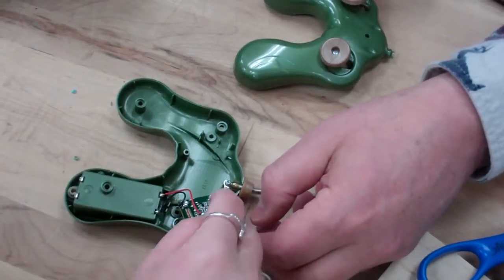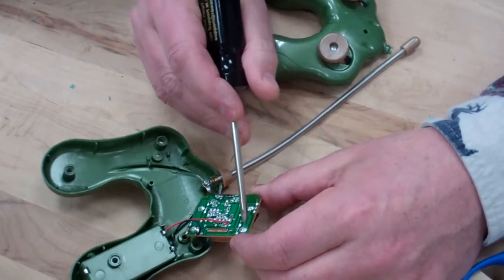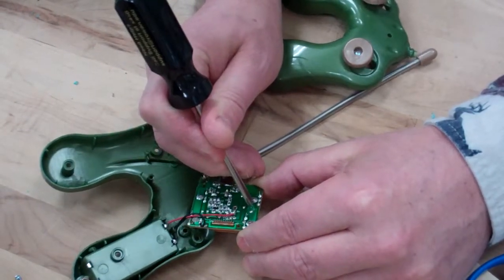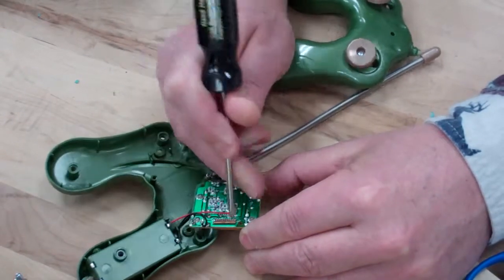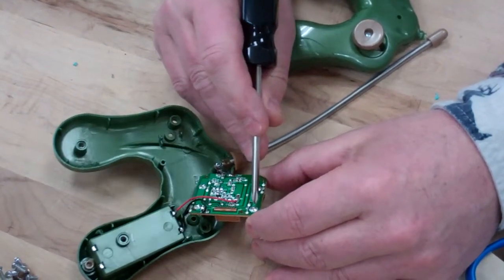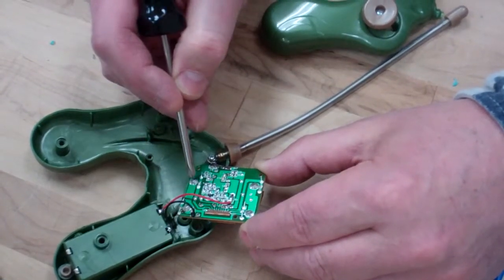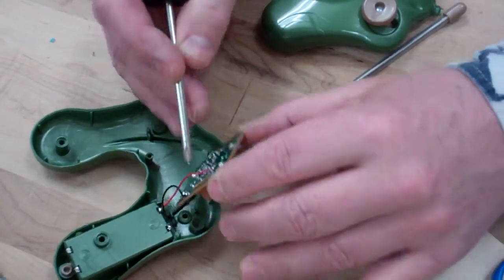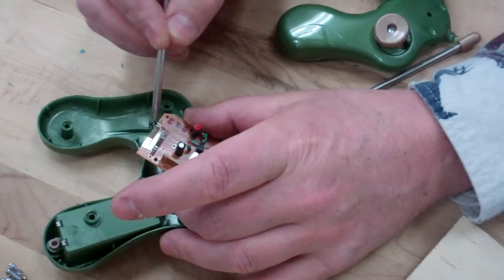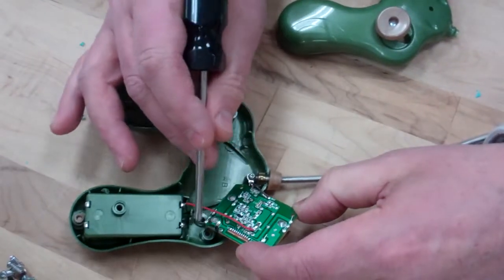So this would be left forward or left backward. The common is shared — if you follow the common around, you can see it's the same piece of metal. The light green is just paint on top of flat metal; if you scratch the paint off, there's metal underneath. Both switches share the same common metal line, and that common is actually connected to the negative part of the battery.